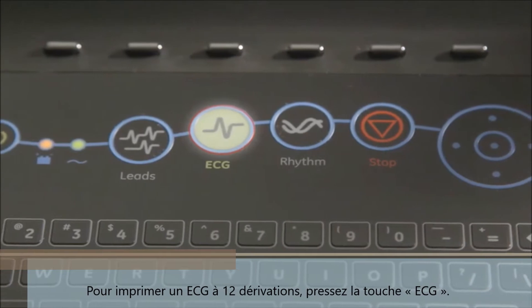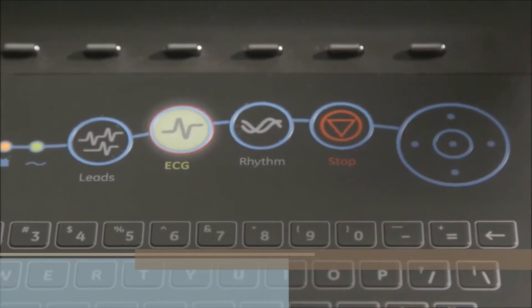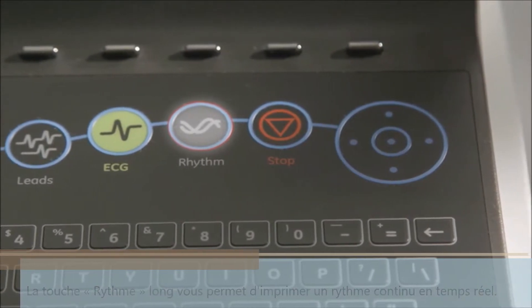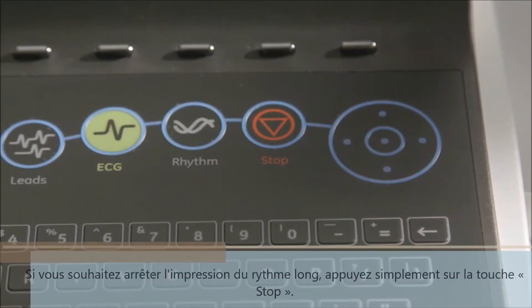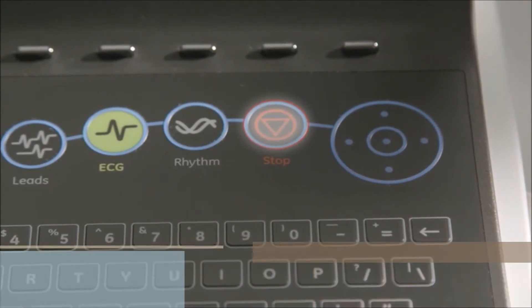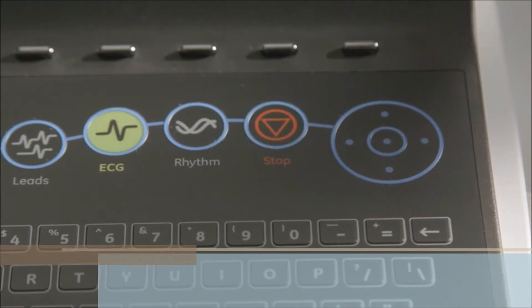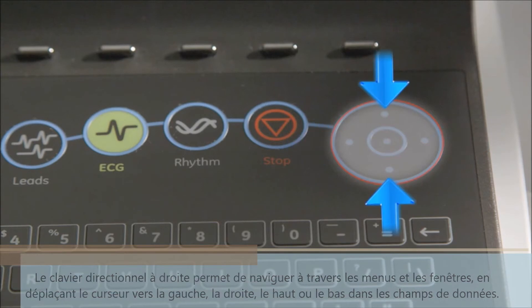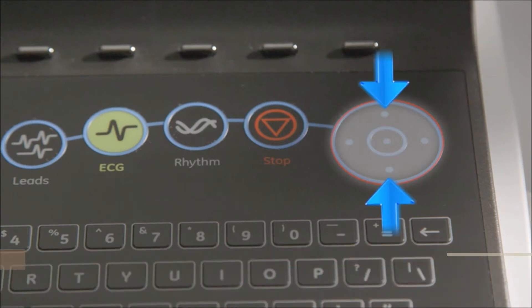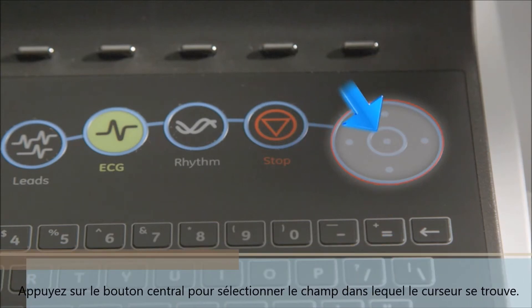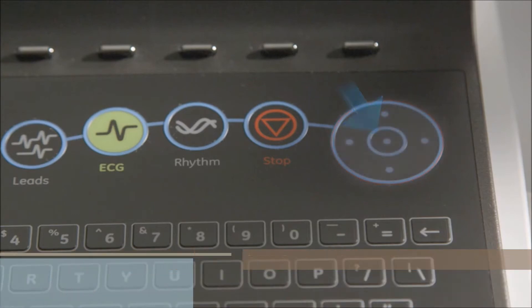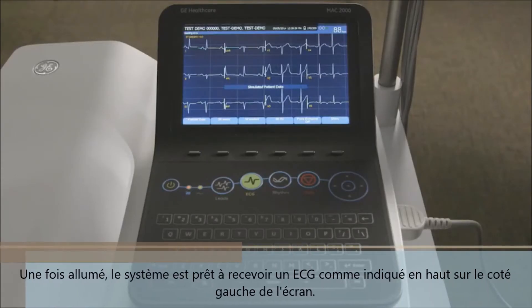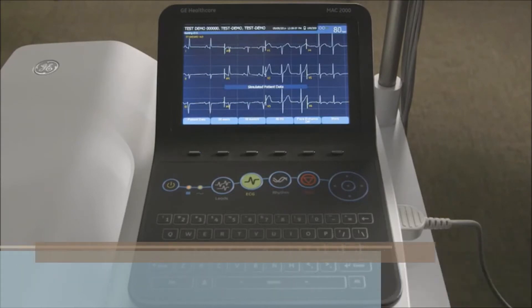When pressed, the ECG key acquires and prints a 12-lead ECG. Next is the rhythm key, which allows you to print a continuous real-time rhythm. If you wish to stop printing, simply press the writer stop key. The trim pad provides movement through menus and windows by moving the cursor left, right, up, or down through the data fields. Press the center button to select the field in which the cursor is currently resting. Upon startup the system is ready for acquiring an ECG, as indicated at the top left-hand side of the screen.